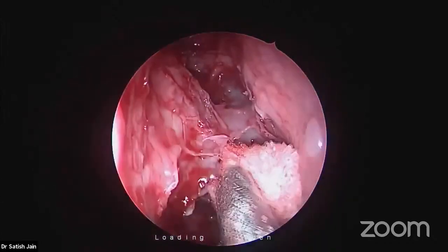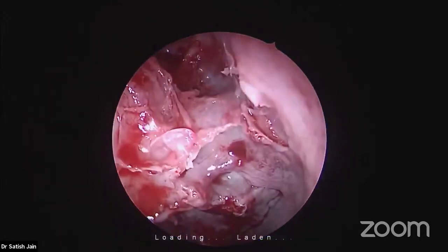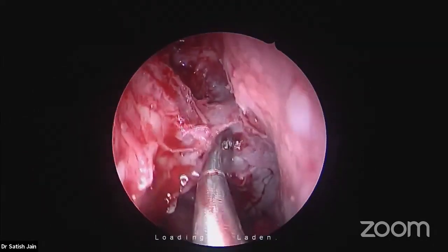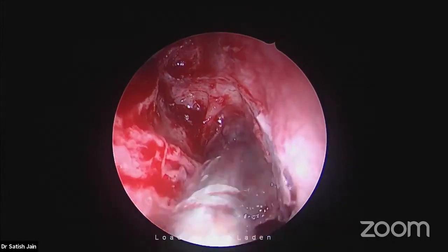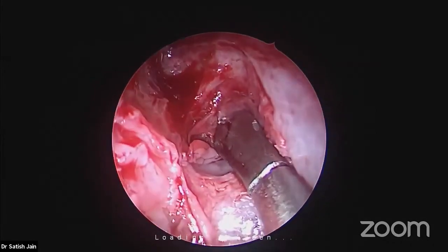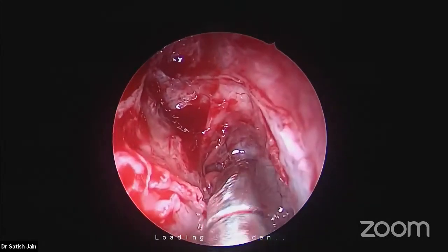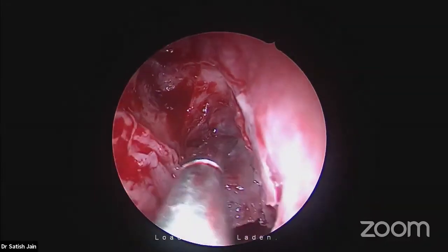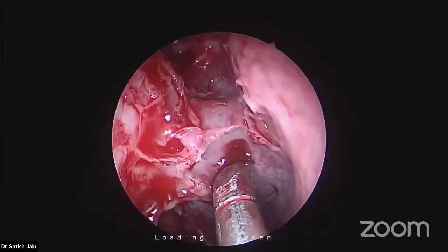Now see, this is the ground lamella. See its superior attachment to the skull base here. This is the ethmoidal skull base anterior to the anterior ethmoidal artery. This is the ethmoidal skull base behind the artery. And this is the area where the ground lamella is inserted on the skull base. Roughly 1 or 2 millimeters behind the anterior ethmoidal artery is the ground lamella insertion. And behind that, the posterior ethmoid starts.